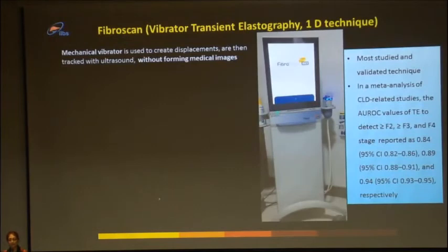This again is not workable for the liver, because when we are looking at the liver, we don't know which are the normal portions versus abnormal portions, but it can be used for focal lesions. I'm not going to be covering focal lesions in this talk.